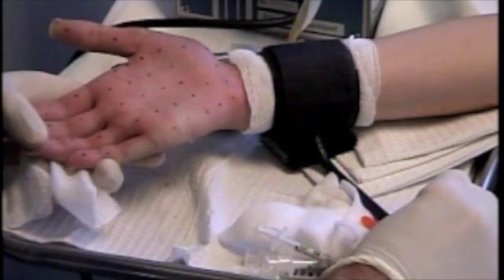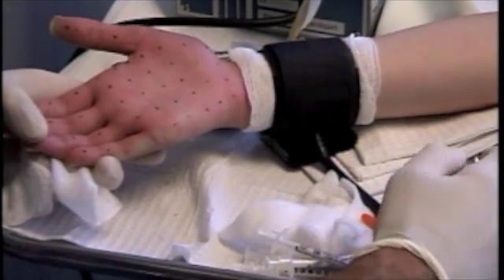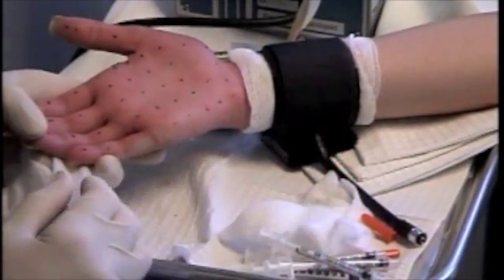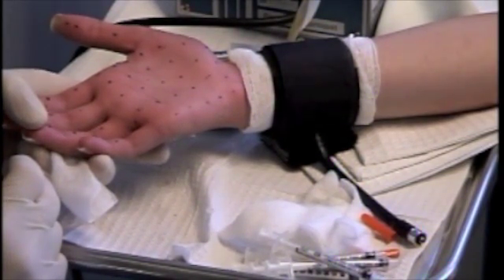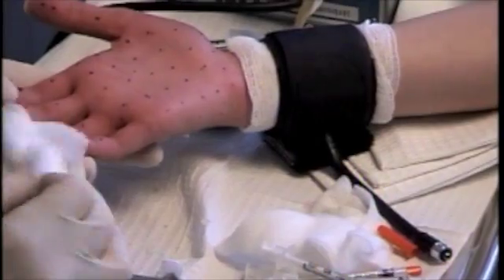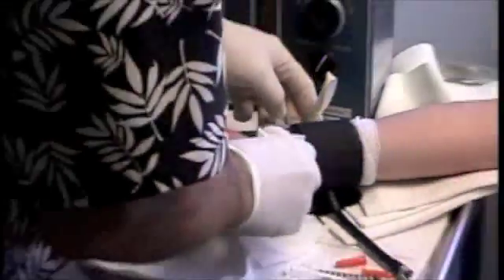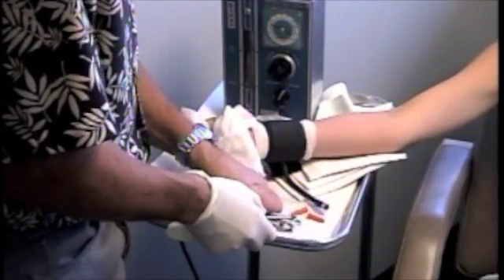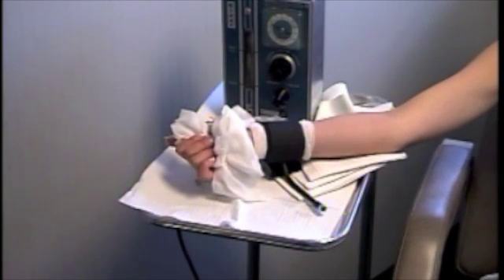Even though the tourniquet has been up only approximately five to six minutes, I let it down slowly anyway, and you can see the blood rushing back into the hand. Because I've used a horizontal injection technique, there's very little, if any, blood coming out from the injection sites, nor any Botox oozing out of the skin — the Botox essentially stays in the skin and does exactly what it's supposed to. Some people fear that injecting this way and then pushing the blood back squeezes the Botox out, but when done correctly, this does not happen. Her skin returns to normal color. I'll wipe off the marks and the slight puncture marks will go away shortly. This technique has worked for over 300 patients that I've injected, and I'd be happy to discuss this with you in detail — please call my office at 925-975-3353 or visit www.bridgesmedical.com. Thank you very much, and I hope this was educational.